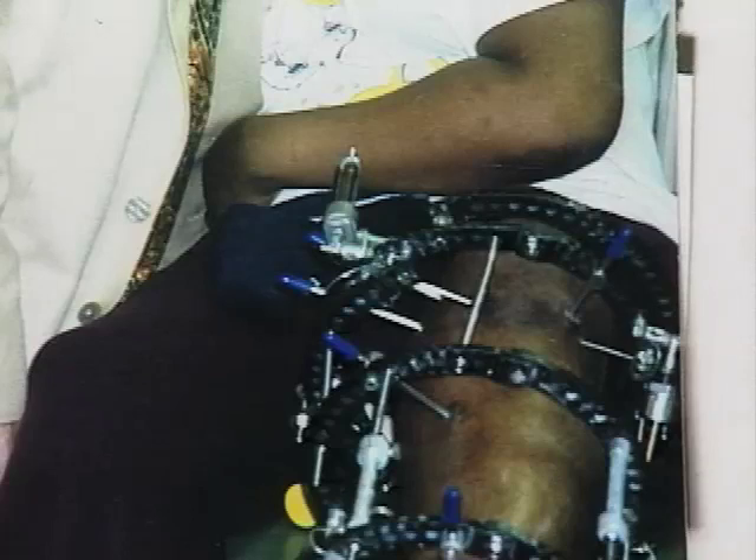Prolonged consolidation time is the most difficult aspect for the patient to tolerate in the femoral lengthening procedure. Because of his stature, which is five foot six, he did not want to lose one inch in height, and therefore he elected for a leg lengthening.